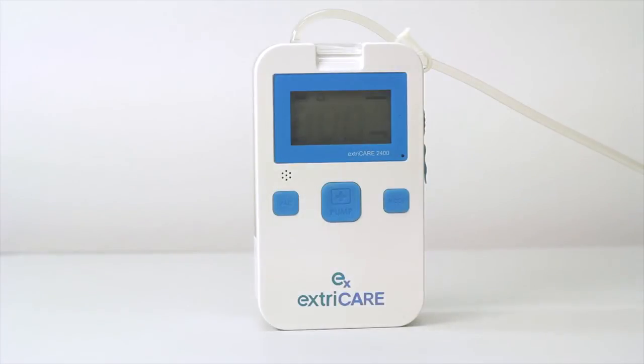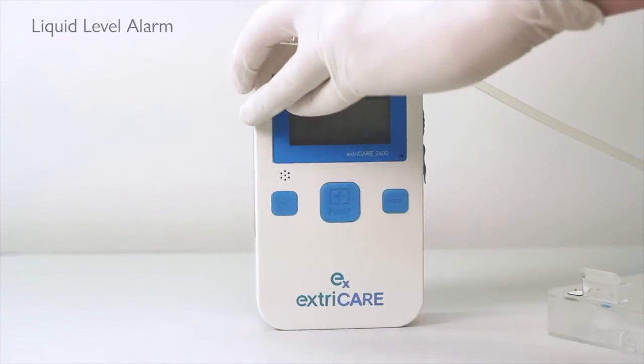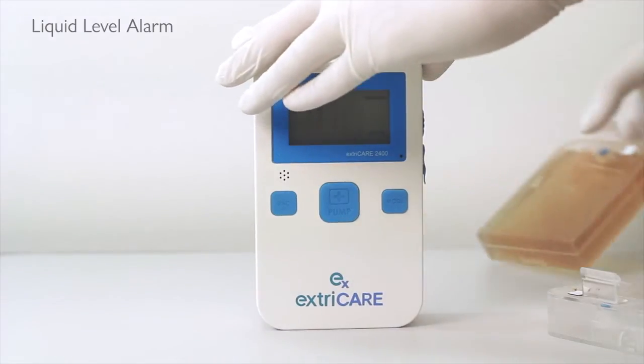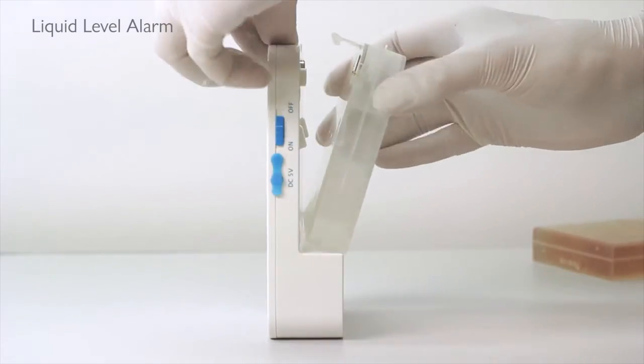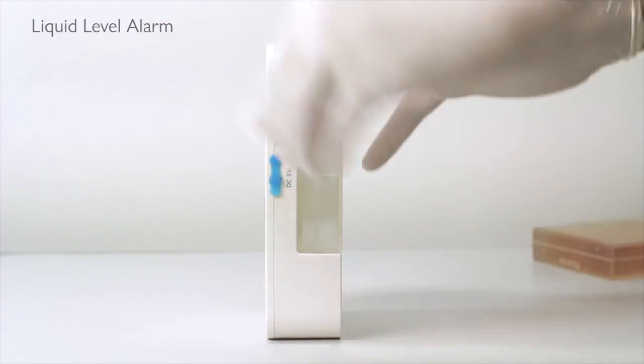When the liquid level in the canister is full, the liquid level probe will become short-circuited. The LED light will illuminate and the alarm will sound. The pump will power off immediately until the canister is changed.